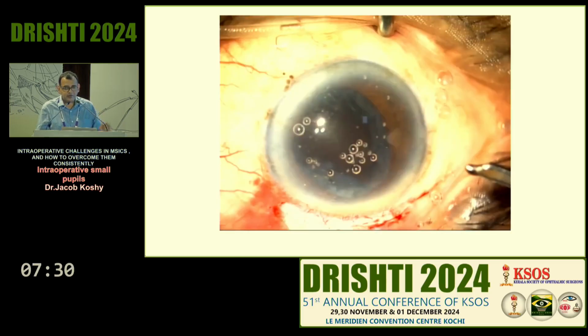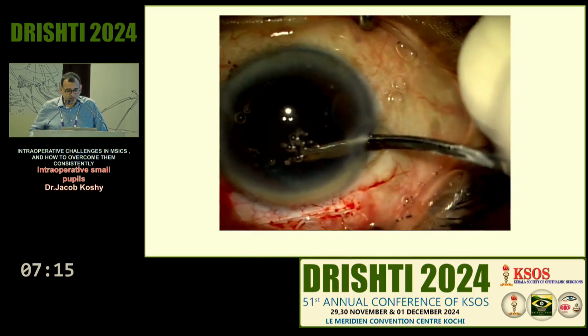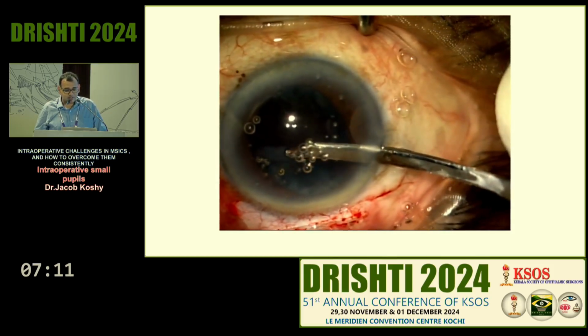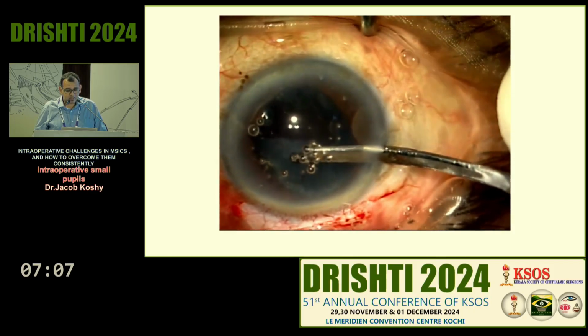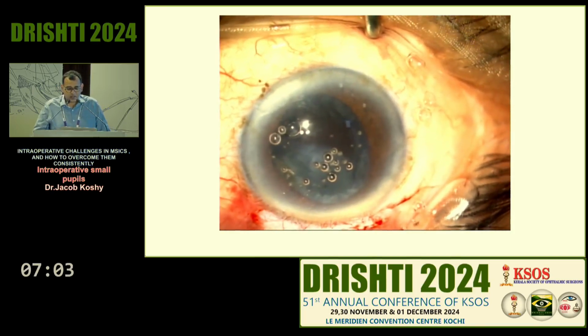And then sometimes you have these cases where, when you have the problem, you start wondering why you became a doctor, or why you took ophthalmology, or sometimes you start wondering why you were even born, those kinds of things. And you're doing the case, and then half the nucleus has gone into the vitreous, and you have all kinds of things, and you're just trying to see what's happening there, and you see that the nucleus is floating in the mid-vitreous cavity, and you're desperate.